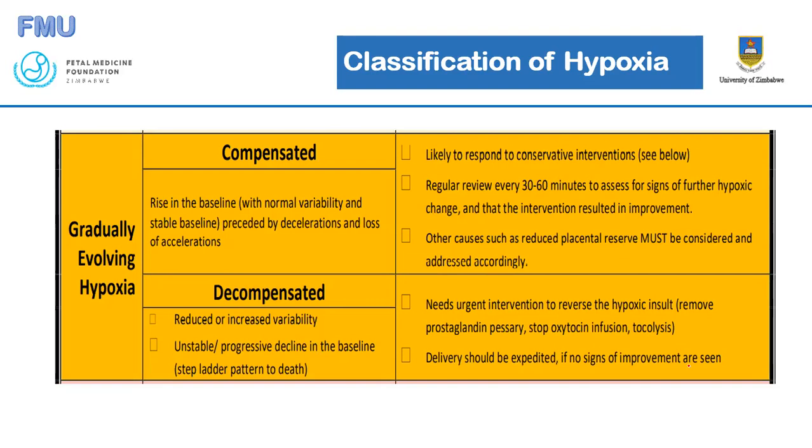May I also add something to that? I think the purpose of monitoring the baby with an abnormal CTG, with the high risk, is to discover if there is a problem and then do an intervention. So I don't think you will continue monitoring that fetus forever. If there's an abnormality, then obviously you need to do an intervention.